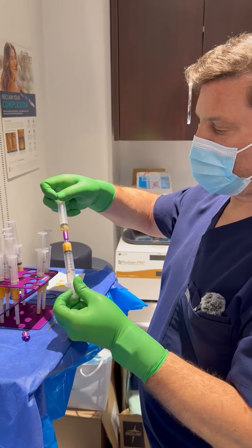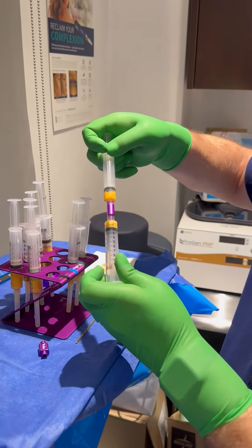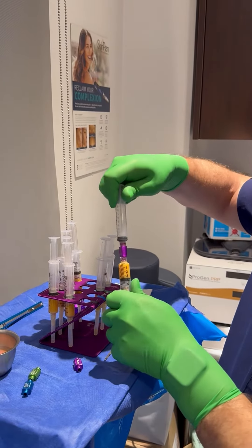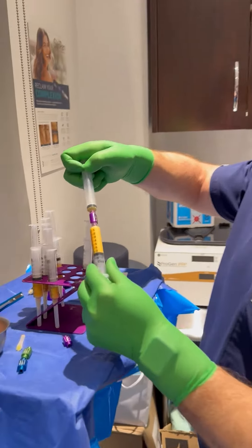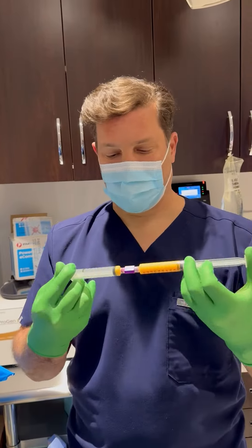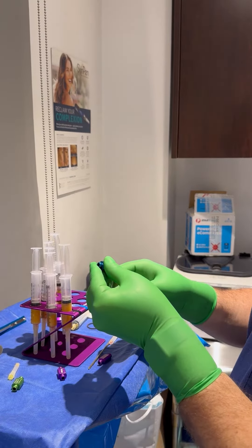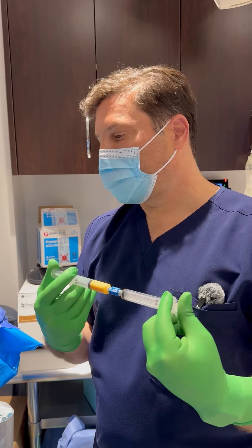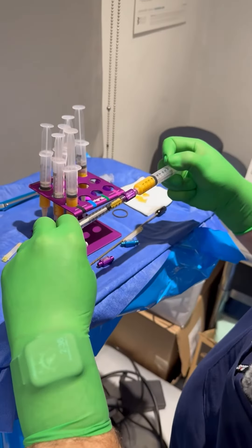We're going to pass it through the 1.4 filter, passing it back and forth about 30 times. This emulsifies the fat and makes it easier to inject. You go progressively smaller — 2.4, then 1.4, then 1.2 for micro. This has already been processed; all we're doing is transferring it for injection.